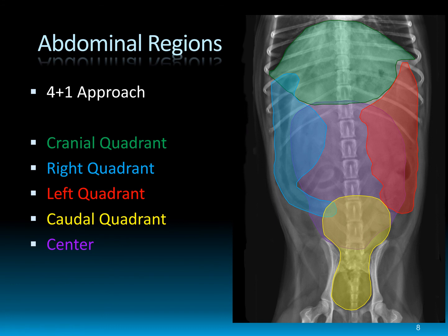But again, this is where you figure out what you want your general approach to the overall abdomen to be, and then you go looking quadrant by quadrant, making sure you're looking for all the organs you're supposed to. A lot of people may start in the cranial quadrant, look at everything there, then move to the left quadrant, then caudal, then right, and then end in the middle. Obviously, you can do that counterclockwise. You could start with the caudal quadrant and go toward the cranial.